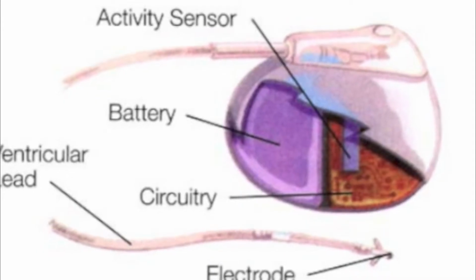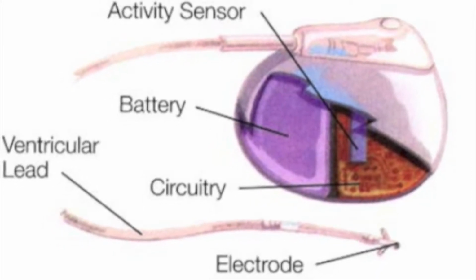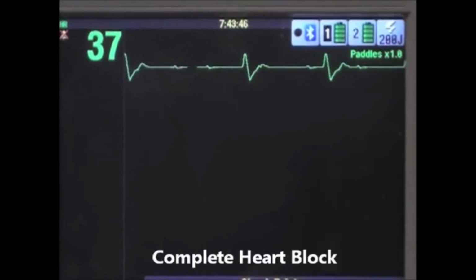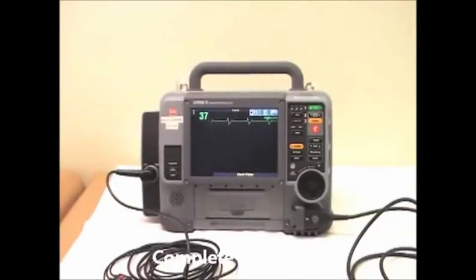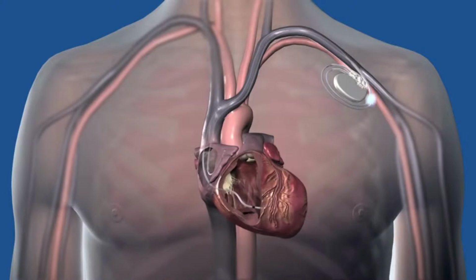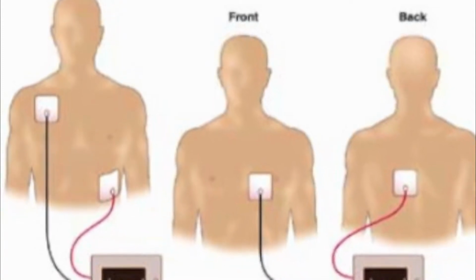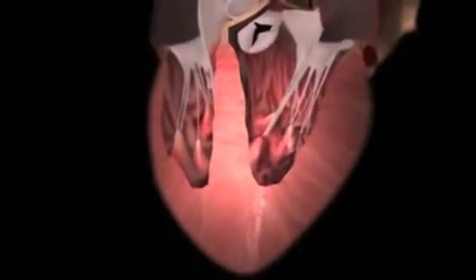An artificial external pacemaker is basically a medical device which consists of a battery, electronic circuits, computer memory, and electrodes. The device's job is simply to sense and pace the heart. The device senses the heart by measuring the produced voltage of the heart when it contracts. If the voltage detected is at a different number from the adequate one, it paces the heart by delivering electrical currents which are really small and are measured in milliamps. The current travels through the electrodes which are placed in 2 different locations on the upper body. This as a result brings the heart's rhythm to an optimal range through electrical stimulation.